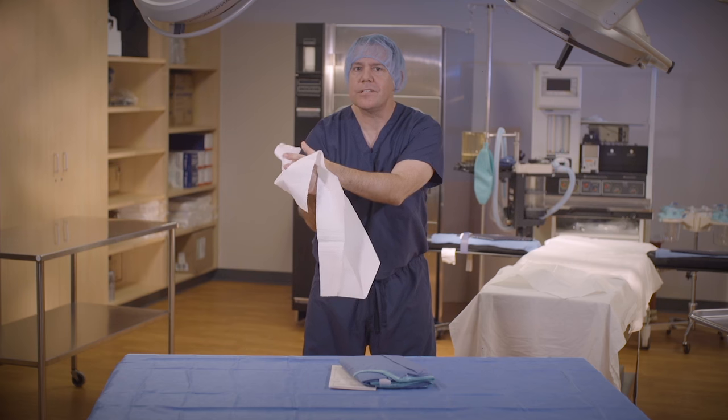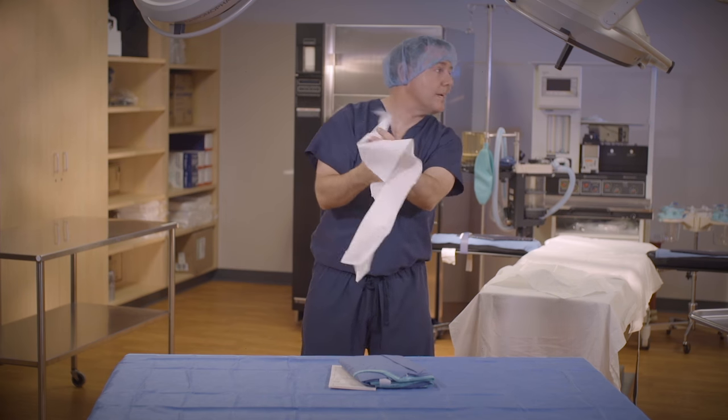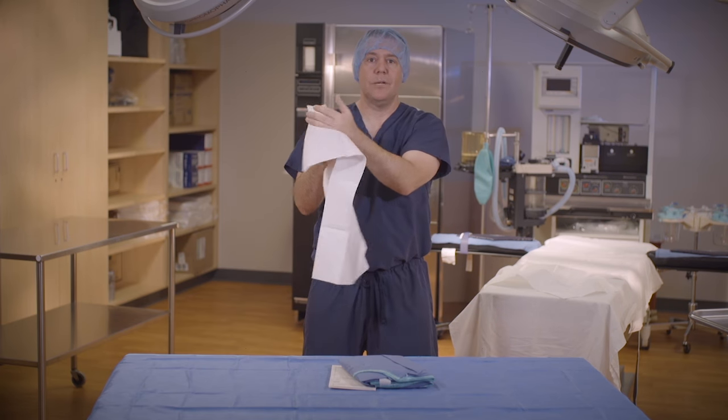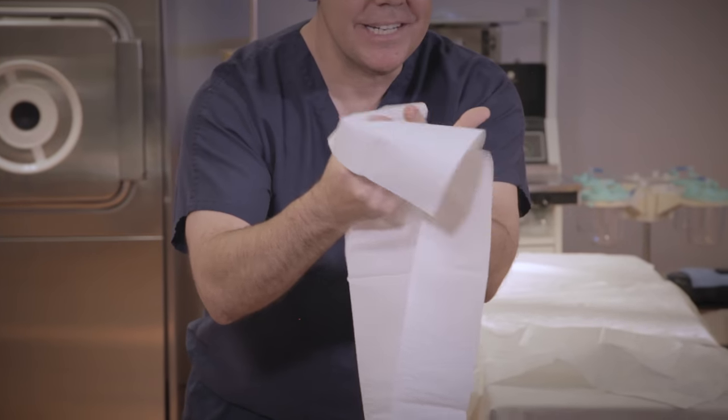Watching experienced scrub techs, you'll find this is an area that they most contaminate. They're too busy talking to their friends or talking to the circulator, and their towel oftentimes touches their scrub top — but we're not going to do that. So making sure I'm drying my hands each section.